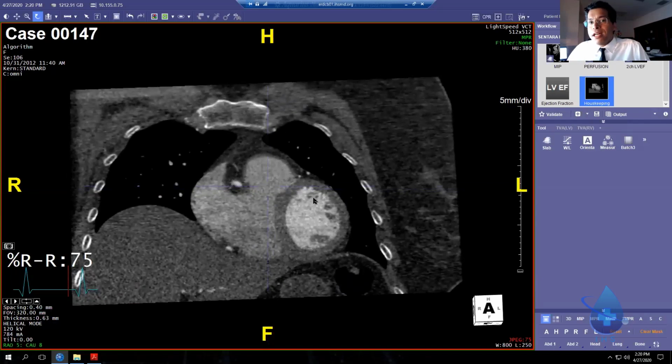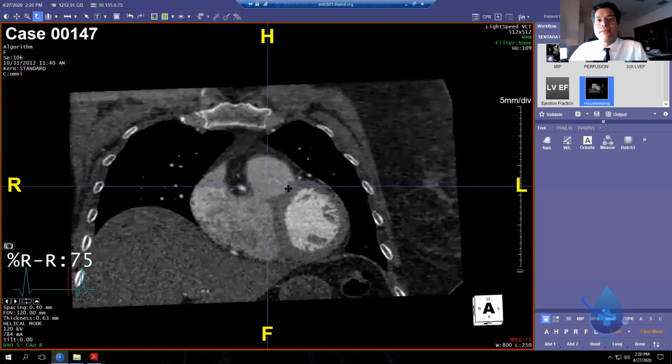There's actually nothing intellectually hard about the pulmonary arteries like there is for the aorta. The pulmonary arteries, the differential is pretty narrow. The differential is clot, clot, clot, clot, and clot, okay, for a filling defect. And then rarely you'll see a clot that keeps getting bigger despite anticoagulation, and it will turn out to be a pulmonary artery angiosarcoma or something crazy like that. I've had one in 15 years. So it's basically PE. So how do you evaluate for PE?